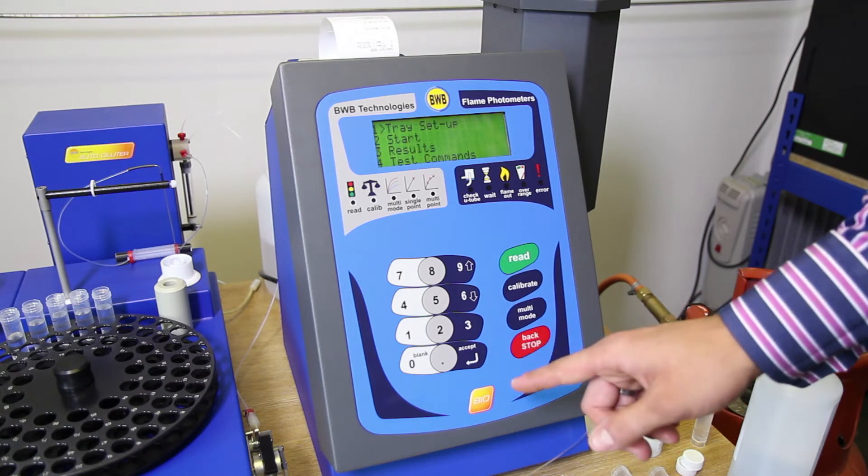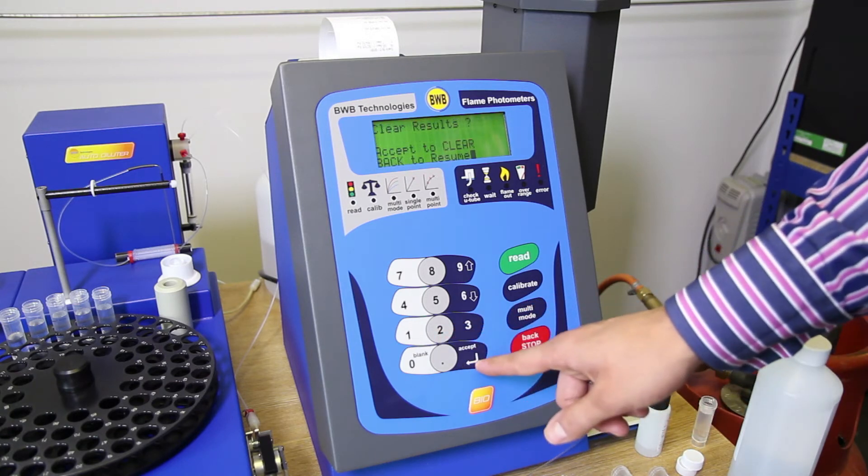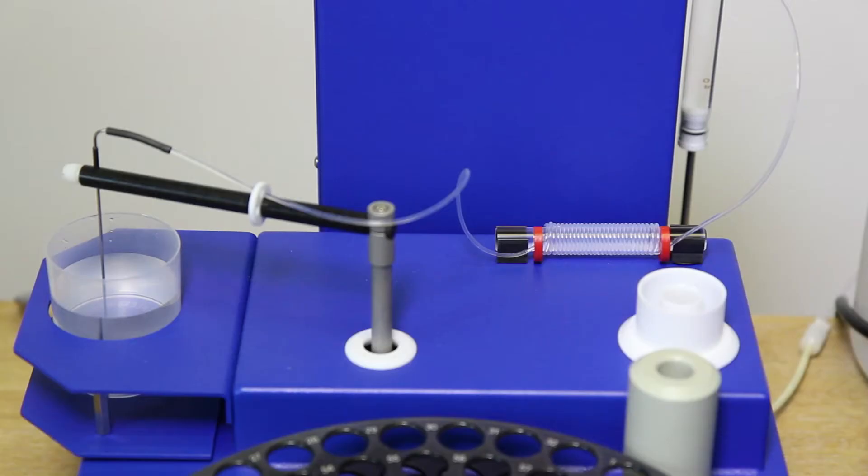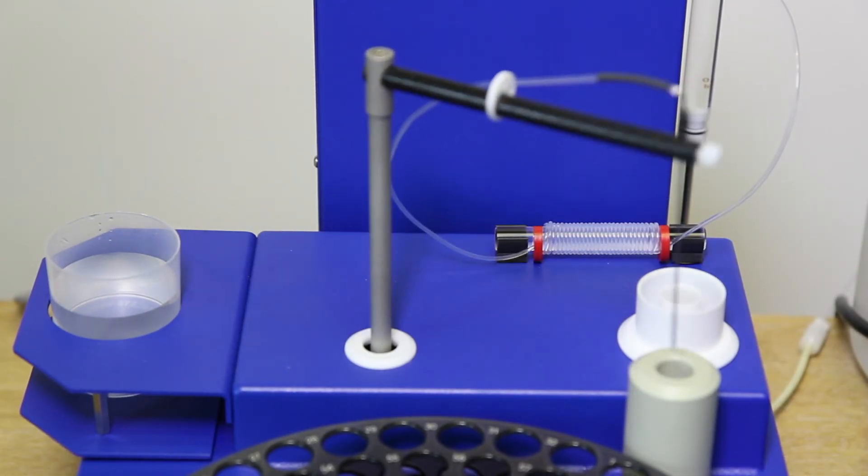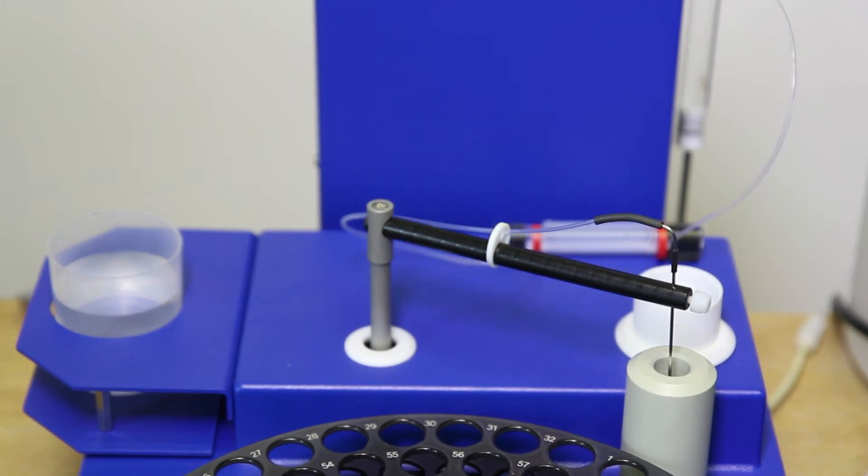The previous results can be erased using clear. When the tray details have been entered, press back and select start to commence the test run. But make sure there is sufficient diluent in the reservoir first.